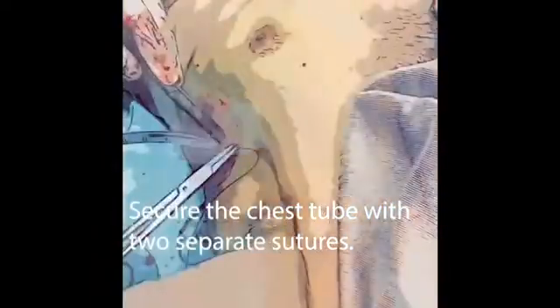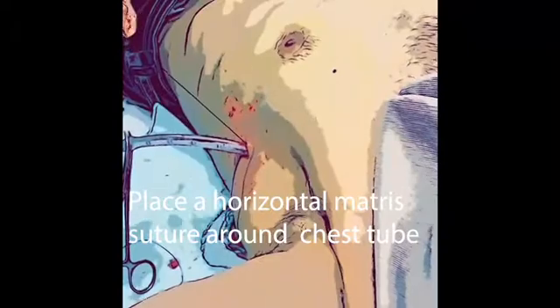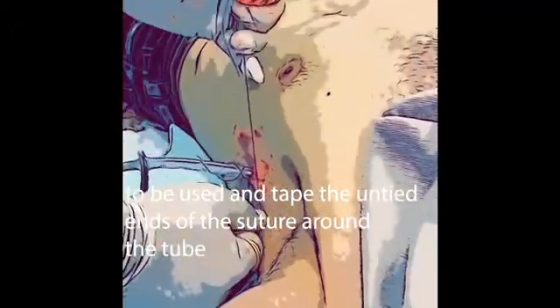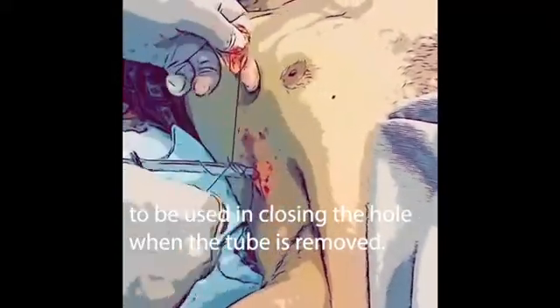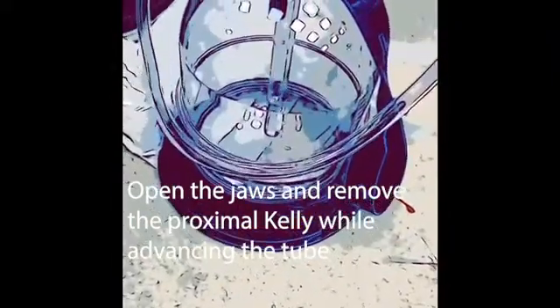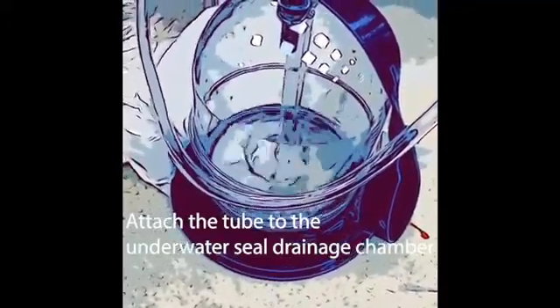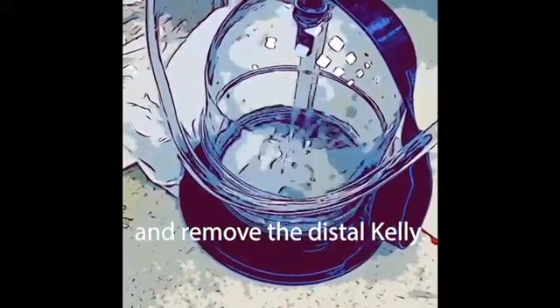Secure the chest tube with two separate sutures. Place a horizontal mattress suture around the chest tube, and tape the untied ends of the suture around the tube to be used in closing the hole when the tube is removed. Open the jaws and remove the proximal kelly while advancing the tube to the predetermined position. Attach the tube to the underwater seal drainage chamber and remove the distal kelly.